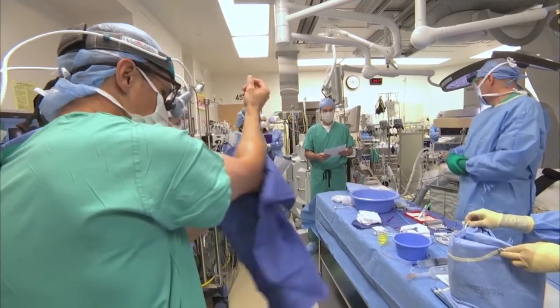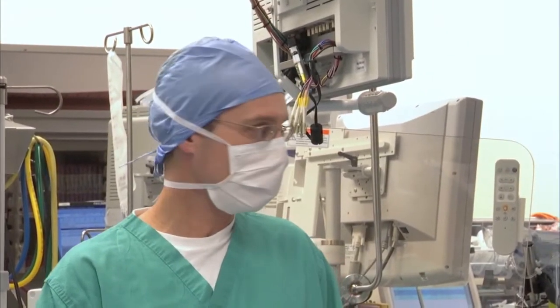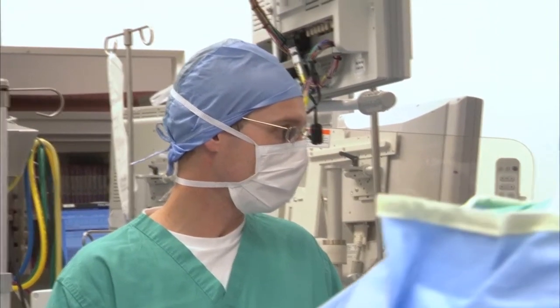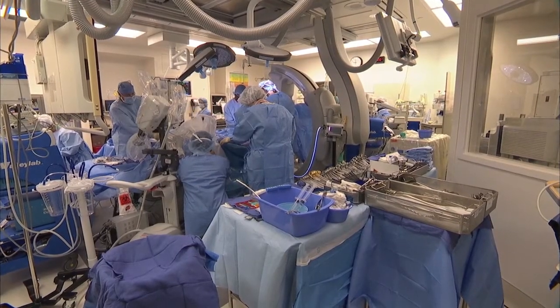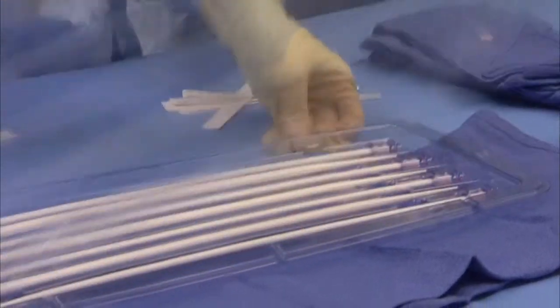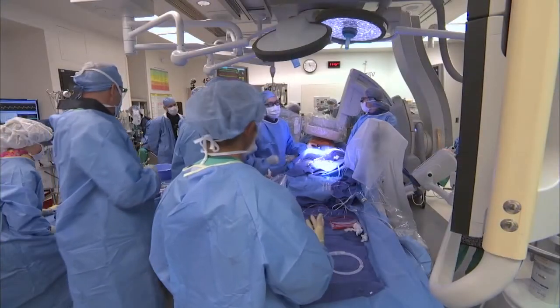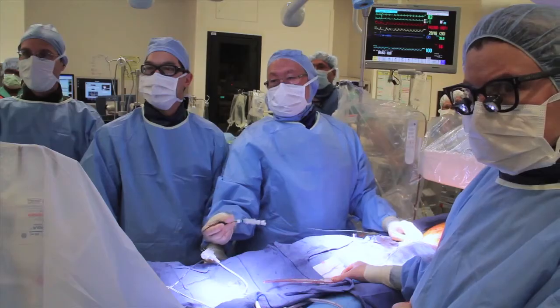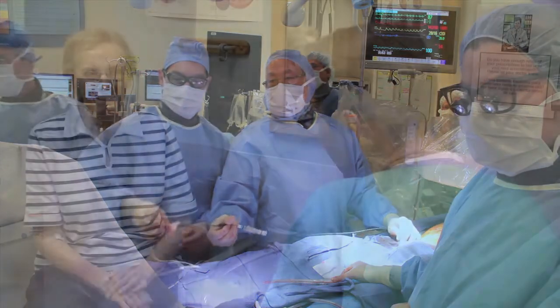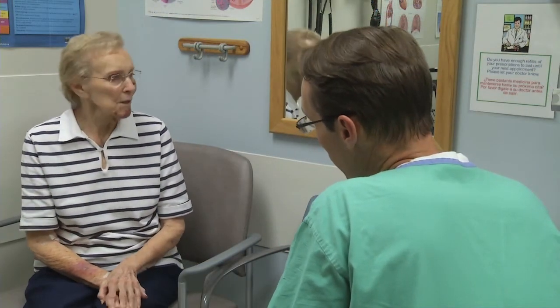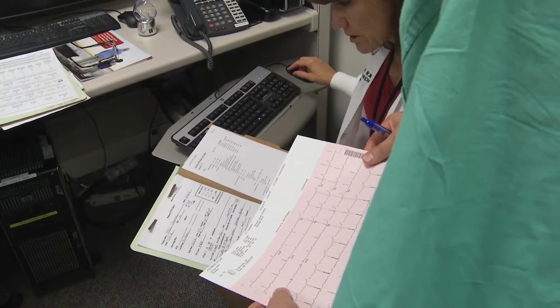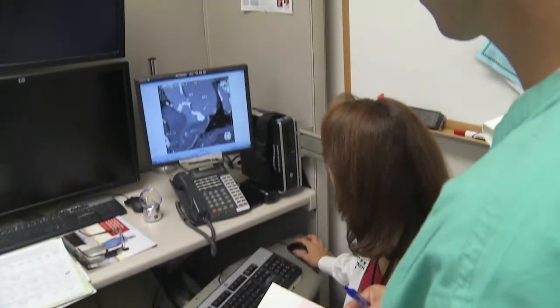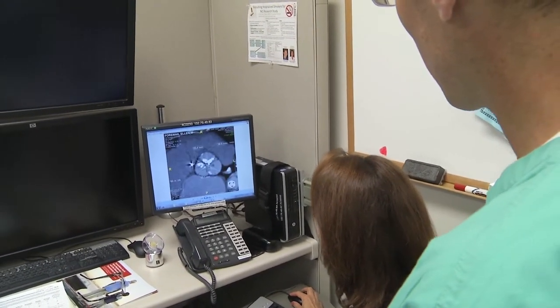Transcatheter aortic valve replacement is one of the newer, less invasive procedures that is revolutionizing cardiac care. In patients at high risk for complications from traditional aortic valve replacement surgery, we can replace a diseased heart valve with a new one without open heart surgery. This catheter-based procedure is similar to others the cardiology team at UC Davis uses to insert stents during angiography. TAVR provides an important option for those who cannot have traditional open-heart procedures, since without surgery, severe, symptomatic aortic valve stenosis is ultimately fatal.